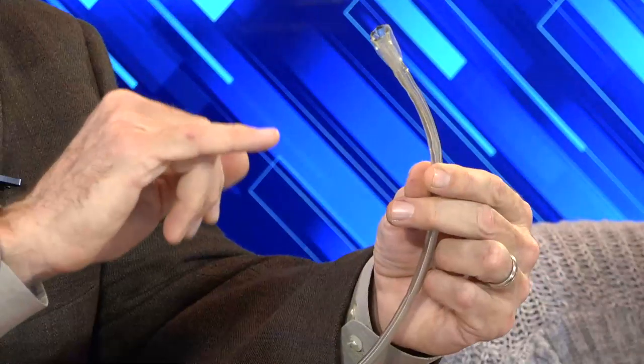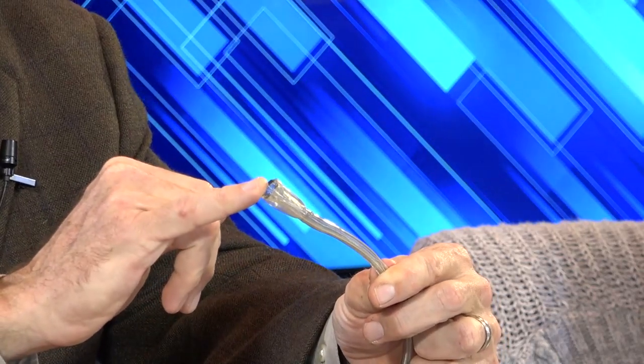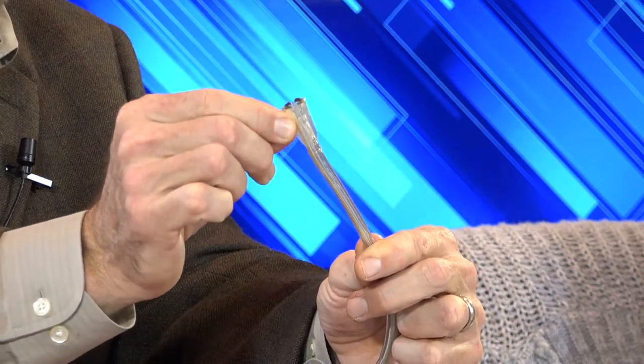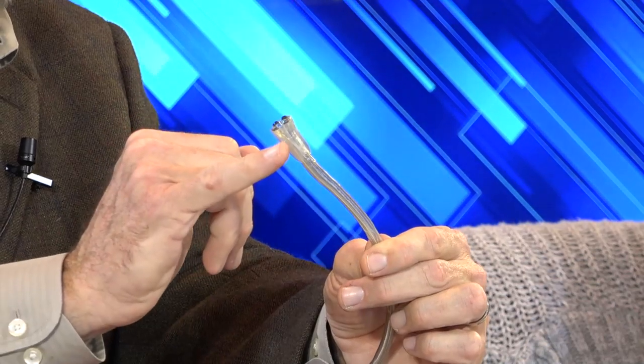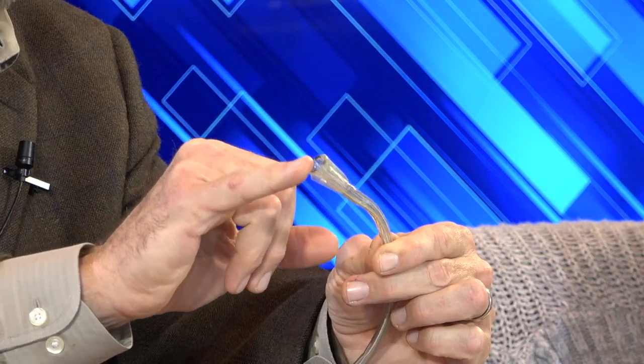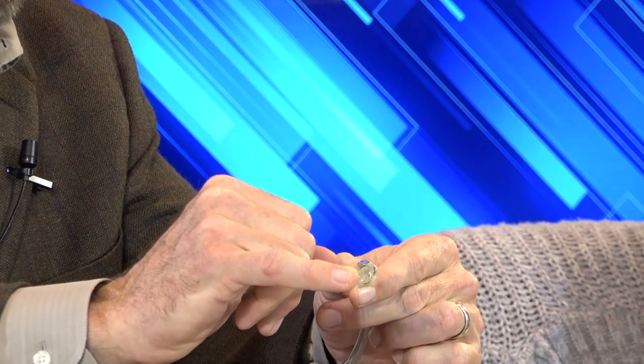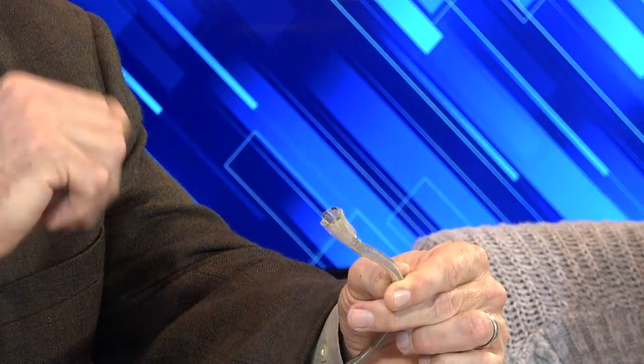So this is our Generation 2 cannula. Can we go back? Here we go. Thanks, Ben. We had radiopaque markers that we added to the distal end. You can see that there's an outer balloon, and the inside is an inner balloon that works to inflate and separate the petals to create a funnel right there at the end. Now, the more fluid you get in there, up to roughly one atmosphere.